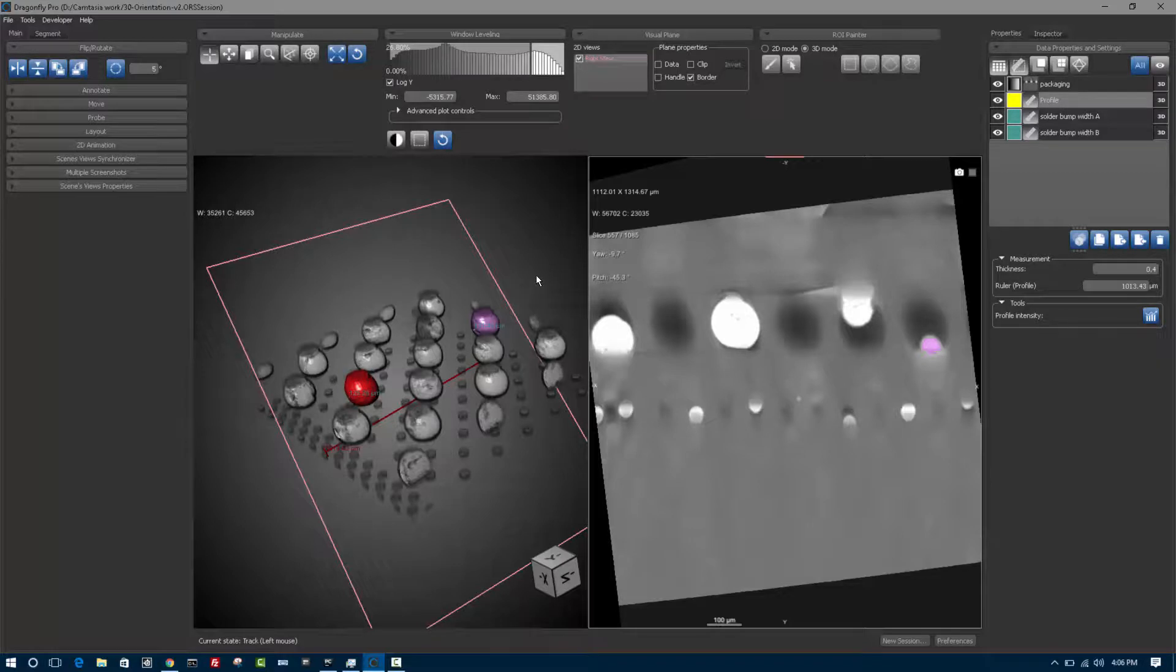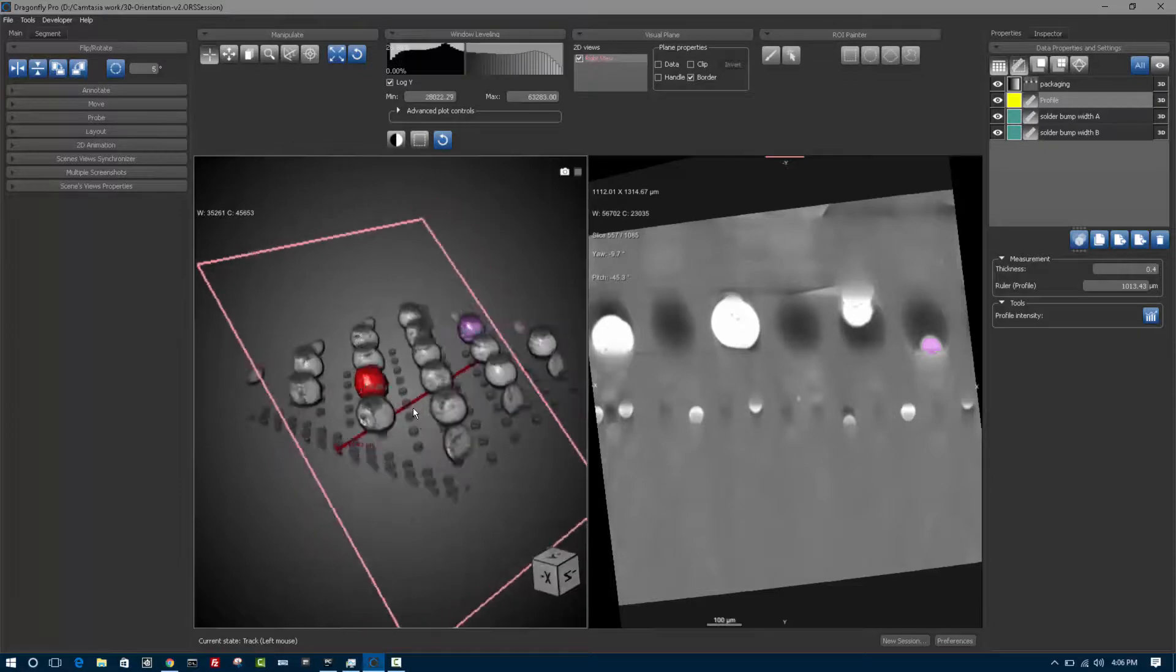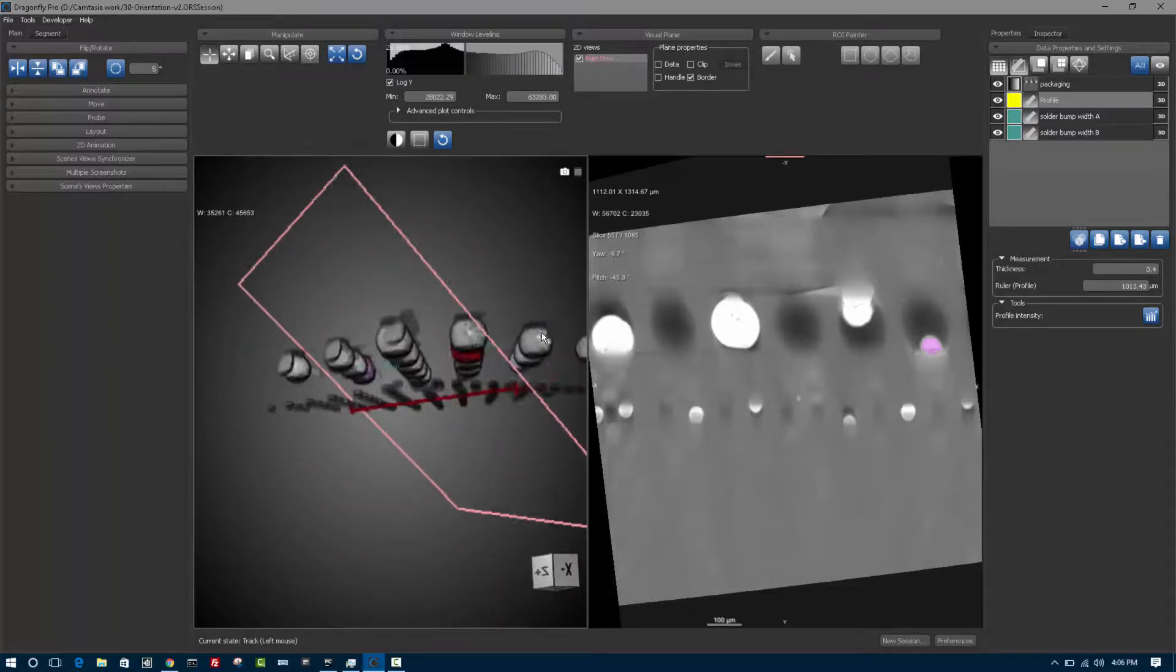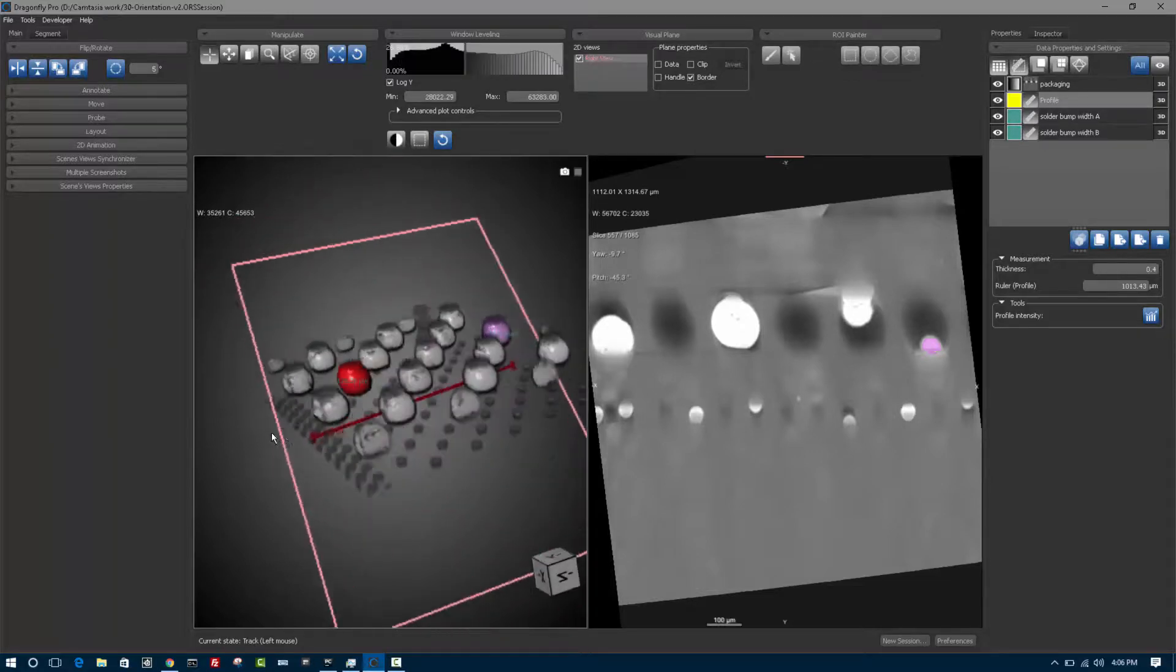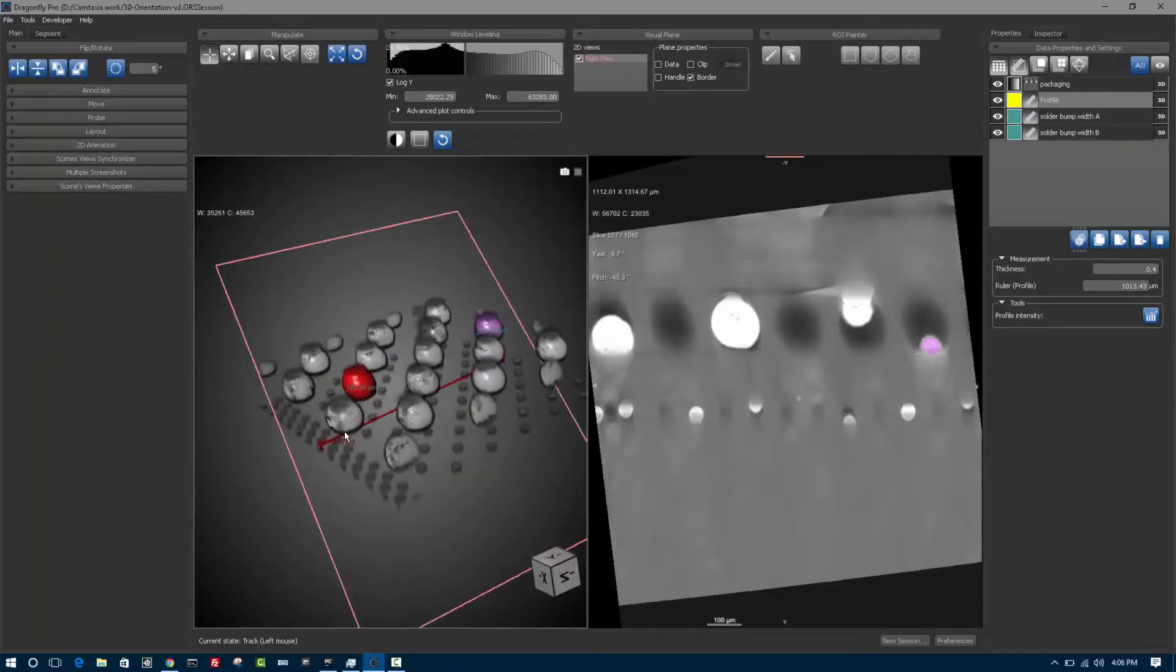Another important feature for orientation is to understand that Dragonfly always puts the user in one state at a time. If you look at the bottom of the screen, it says the current state is now track, which means if I use the left mouse in the 3D view, I can move around in the sample.